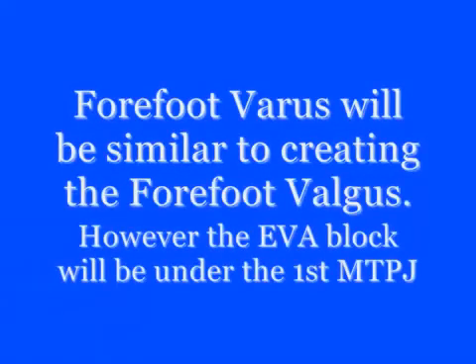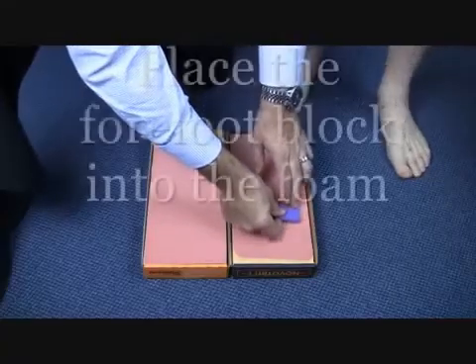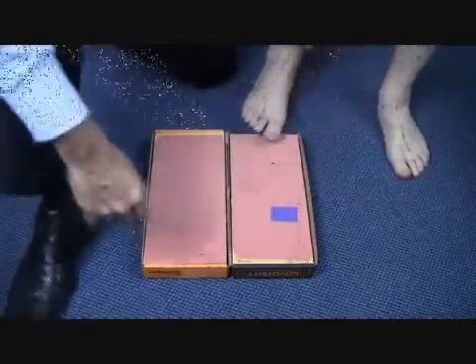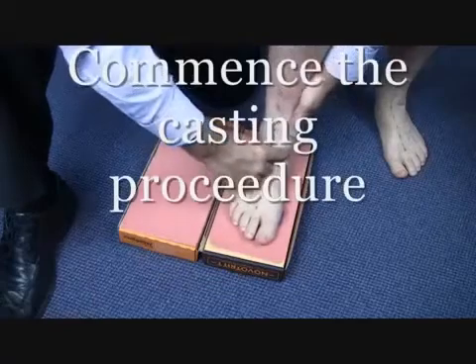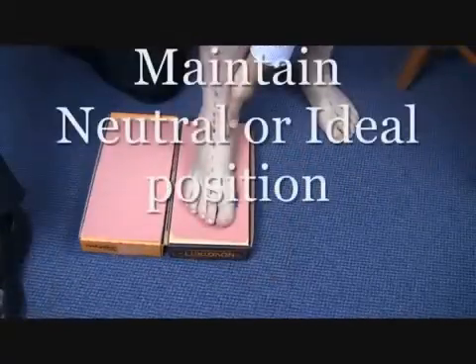Creating a forefoot varus in the foam box is similar to the valgus procedure. For full varus, place the block under the first metatarsal phalangeal joint. Commence the casting procedure and maintain the ideal or neutral position.